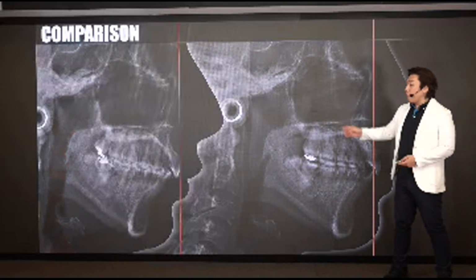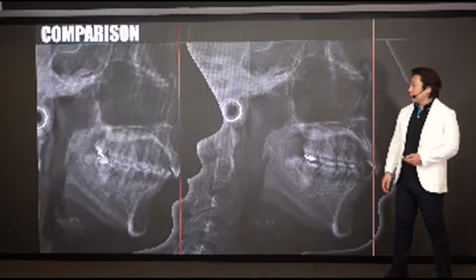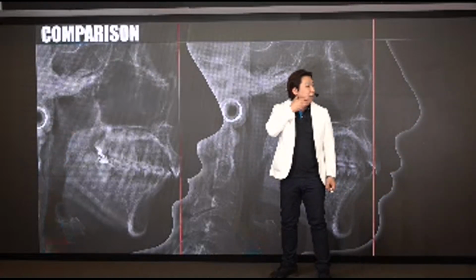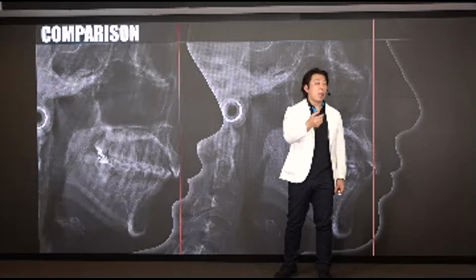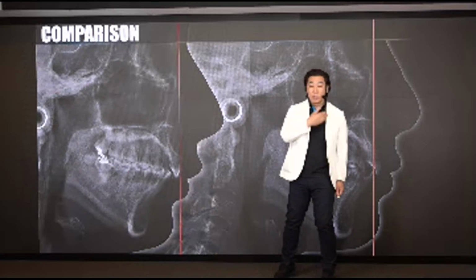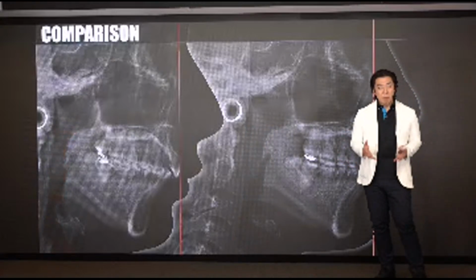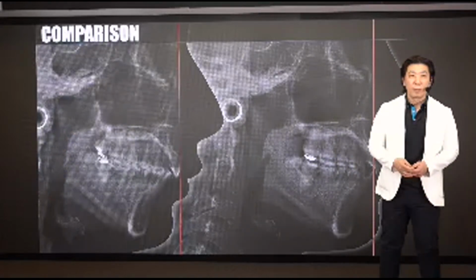This is the airway. Airway is different. Here, at the initial position, the mandible is shifted to the back. Already the airway is very narrow. But after orthodontic treatment, the mandible shifts forward, then the airway is wider. This is a change for sleeping time, no apnea syndrome. Okay.